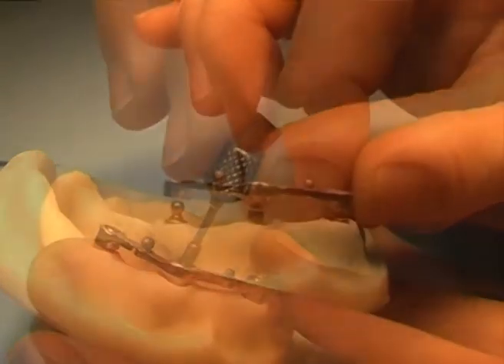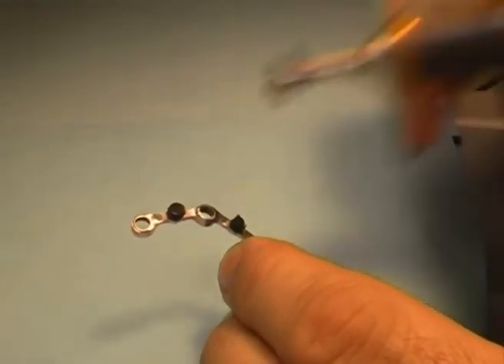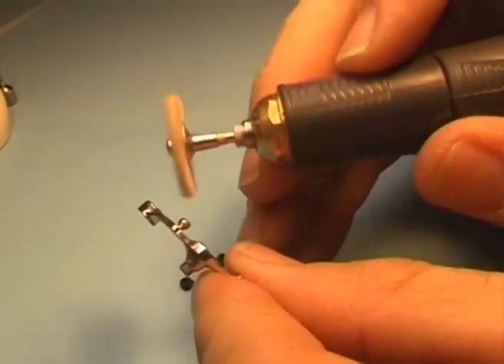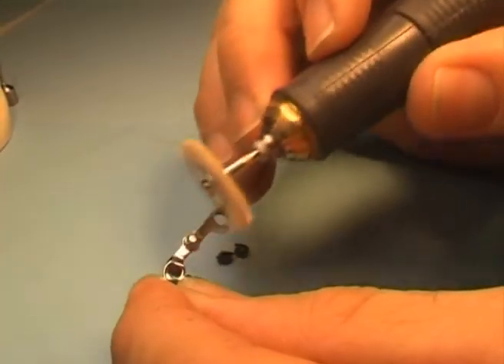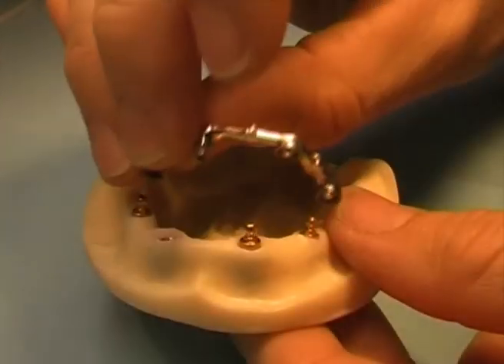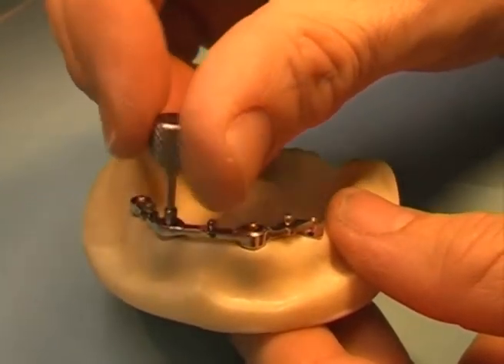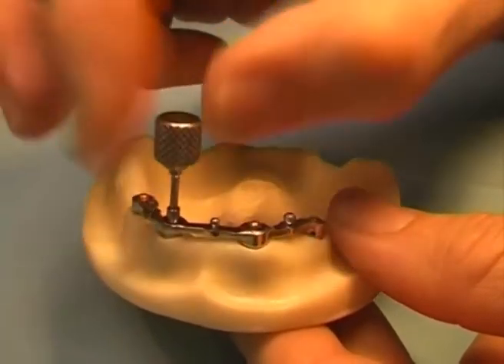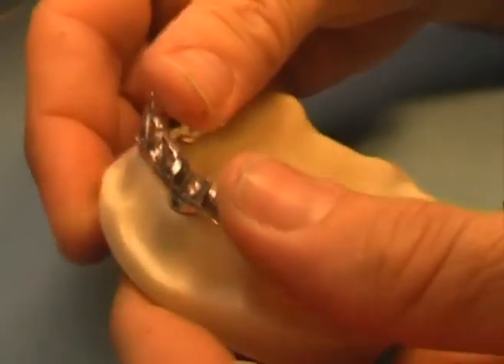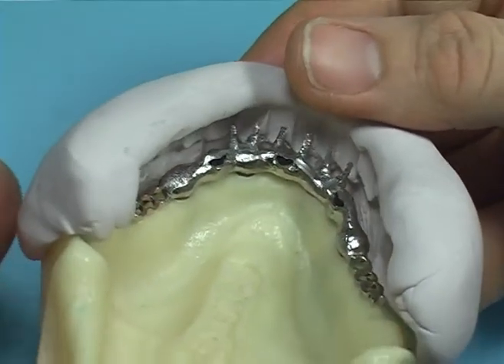Unscrew the bar structure and the attachments from the model. Bar has been previously polished on its surfaces beside the occlusal one, so that below the sphere level it is still unpolished and rough. Now it is time to polish the surface, reducing it in order to have no contacts between the bar and the overstructure. Insertion and functionality will benefit from this procedure.